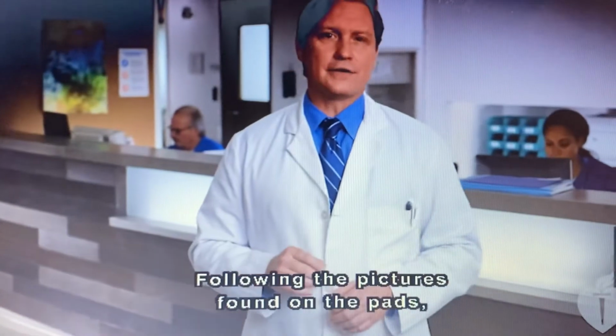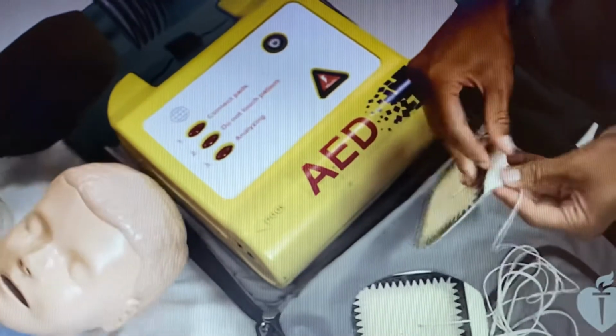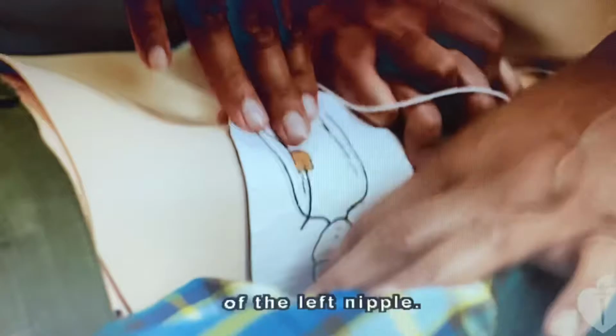Following the pictures found on the pads, attach the adhesive pads to the victim's bare chest. Place one pad on the child's upper right chest directly below the collarbone, and the other to the side of the left nipple. Plug in pad.